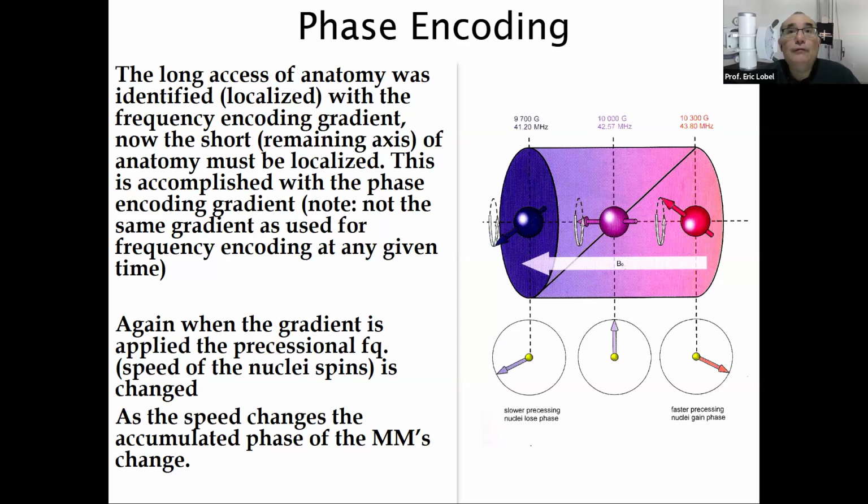So in the case of how do we put a line into K-space, it will work on slope again. If we use a steep slope, when we turn the phase encoding gradient on, when we activate that gradient, it will place information either towards the very top, or if we run the electrical current in the opposite direction, the opposite polarity, it'll put information into the other periphery, right?